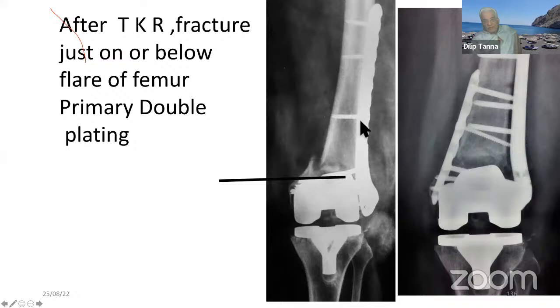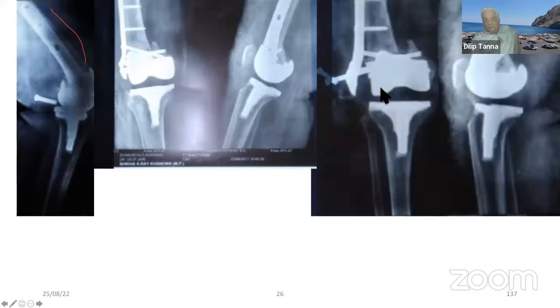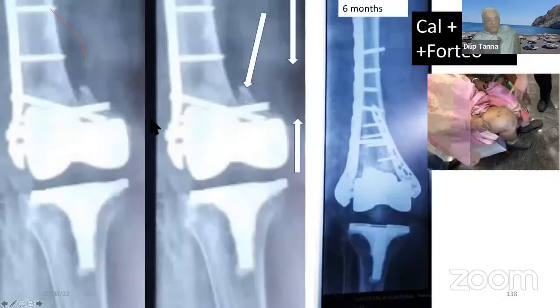Here the surgeon had done alternate screws, but still this is not good enough, because in the distal end there was hardly any fixation. Now you can see here was the fracture. Single plating. It went into complete non-union because there is no hold of the distal fracture. You can see these screws came out. They were in the fracture. And there is no hold. So this is the one.